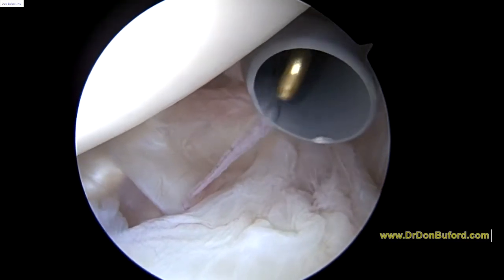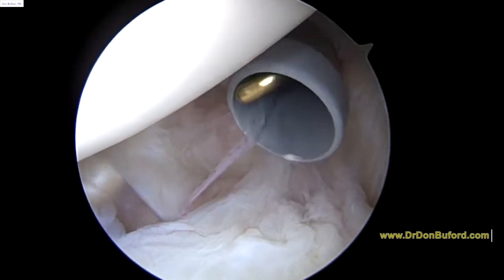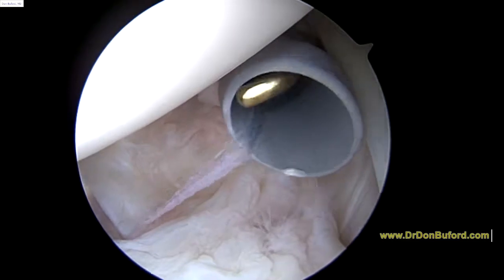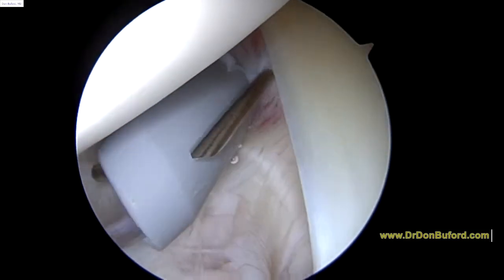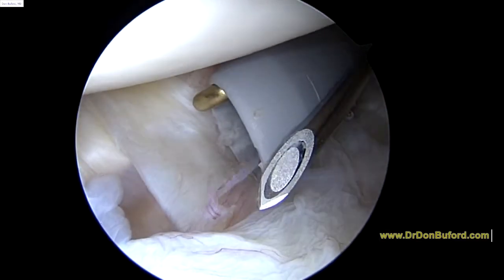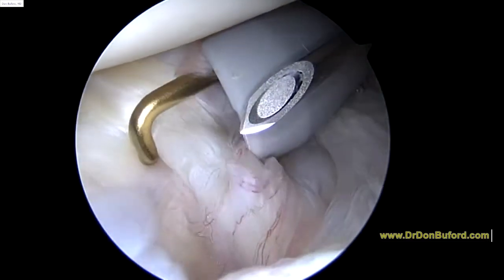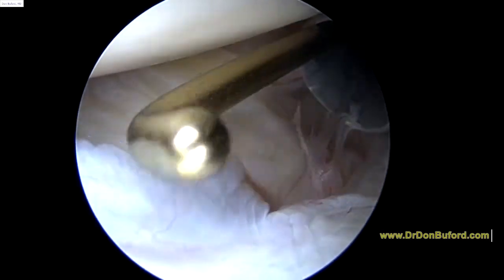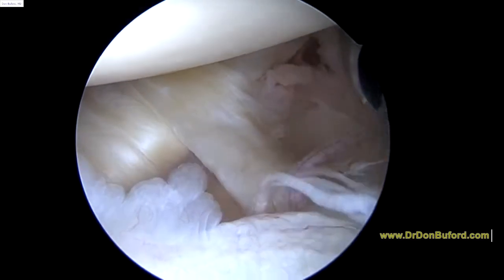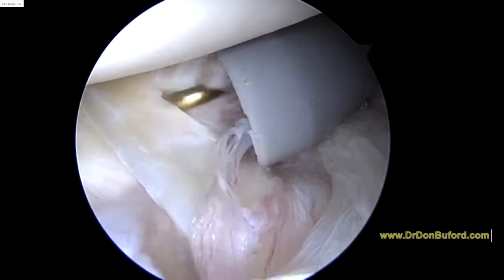And just to give you an idea of the size again, there's the 18 gauge spinal needle, so you can see how the spinal needle is even wider than the ligament here, okay, for orientation. Okay, to the left of that, and crossing it at a 45-degree angle, is the superior edge of the subscapularis tendon. And so the subscap is going to be behind the middle glenohumeral ligament here.